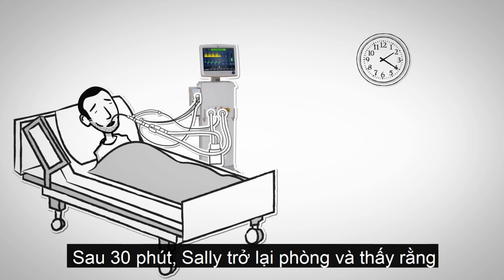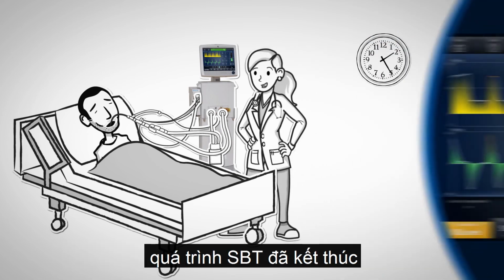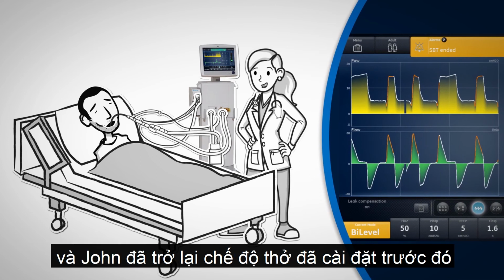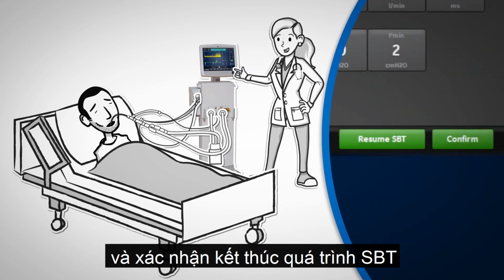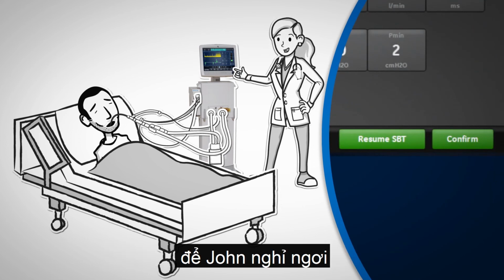30 minutes later, Sally returns to the room to find that the spontaneous breathing trial had ended and John was back on his previous ventilation settings. Sally selects the current mode on the ventilator and confirms the settings to end the spontaneous breathing trial to allow John to rest.